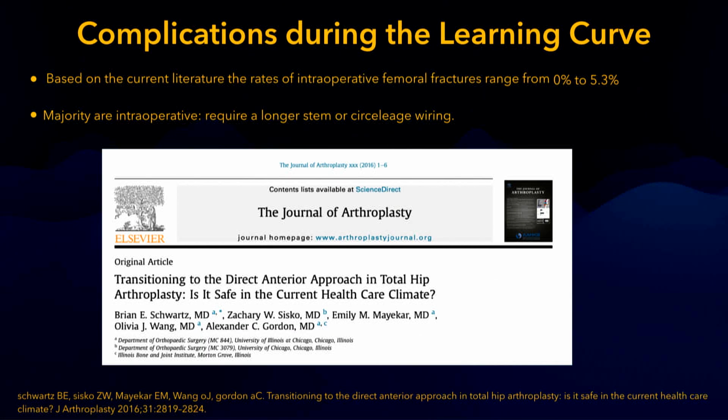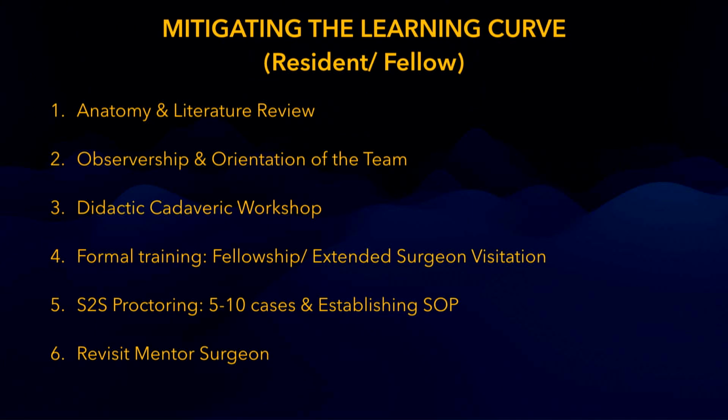Most commonly, complications encountered by us young surgeons in those 50-60 cases are intraoperative femoral fractures. Fortunately, these are calcar fractures or perforations which do not need more than a circlage wire or just a bypass stem. How do we mitigate the learning curve if you're a young surgeon?